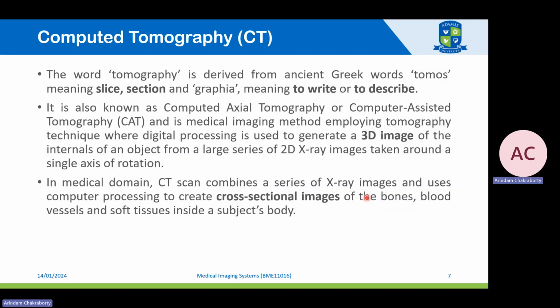Now, coming to the application of X-ray to better visualize the internal structure, it is computed tomography that is commonly used. So, to define computed tomography, the computed part basically means to use a computer to generate the output, to generate the image.